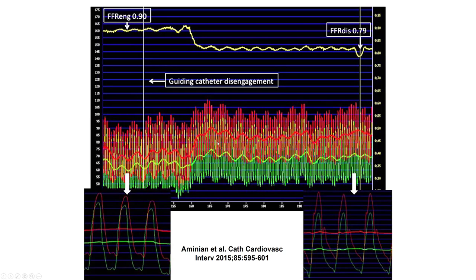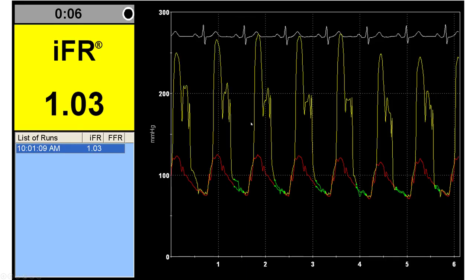The impact of pressure dampening is adverse for both hyperemic and non-hyperemic indices; however, it is more pronounced for non-hyperemic indices. Therefore, before performing any coronary physiology measurement, it is critical to ensure the guide catheter is slightly disengaged and that there is no dampening in the waveform.